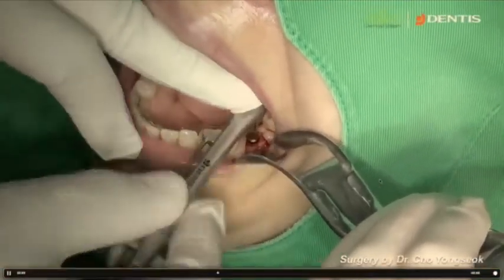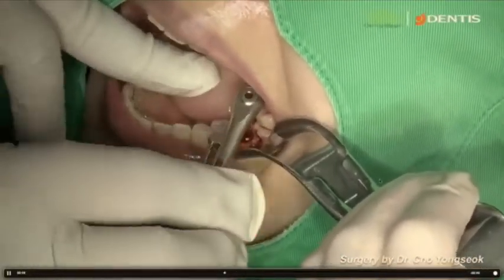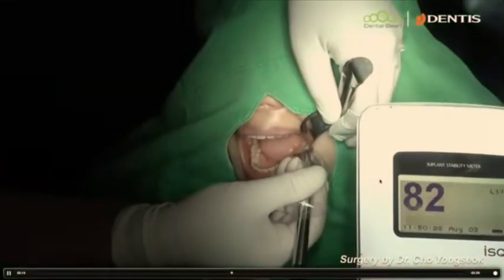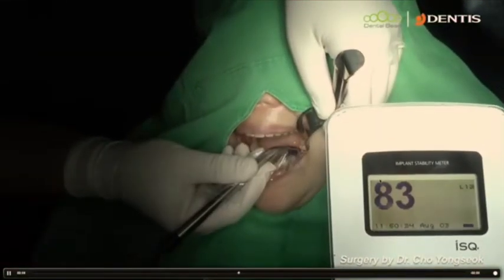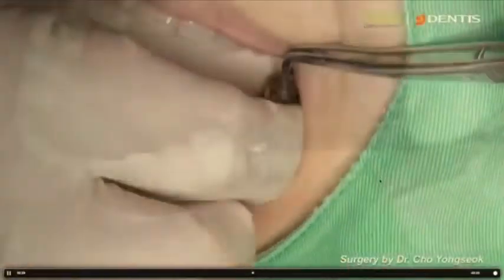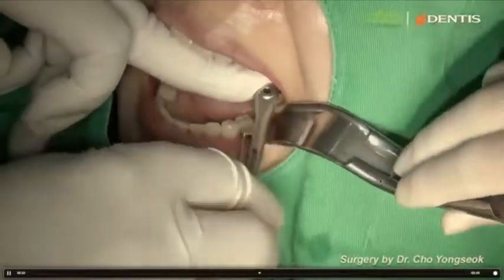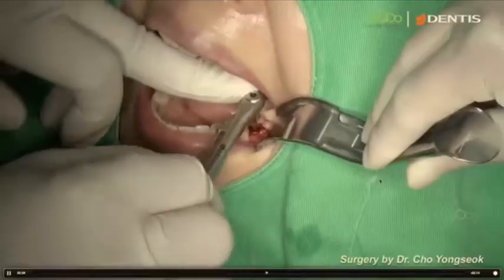A short implant is easy to remove, and when there's no problem, it will be there through the lifetime of the patient. When this implant has a problem, such as peri-implantitis, we can remove it very easily at an early stage and replace it with a new one very simply. Many peri-implantitis cases persist a long time and resorb bone severely. That makes rescue very difficult.